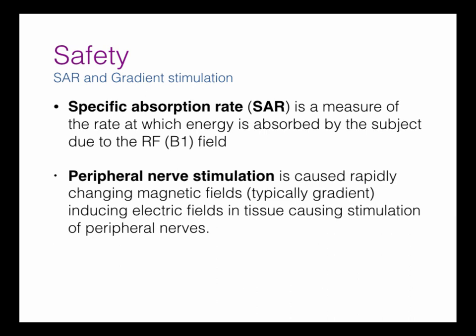What SAR does is it deposits energy into the subject. So it'll cause them to warm up, and there are limits on how much you're allowed to heat up the subject.